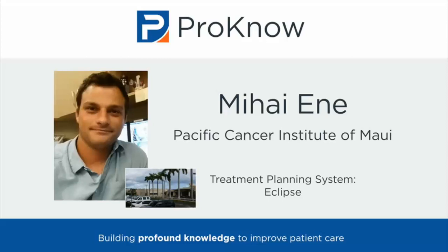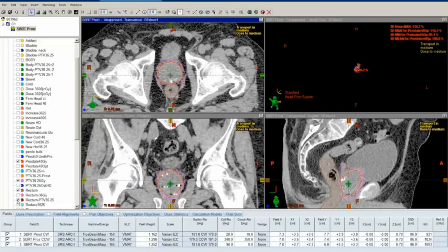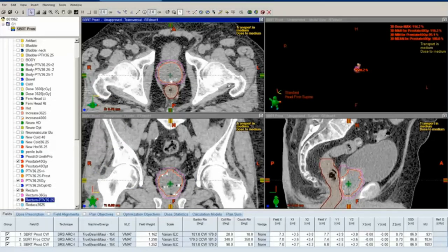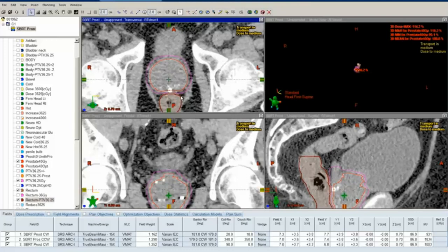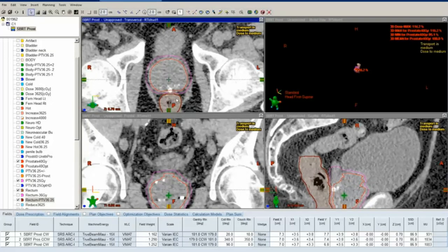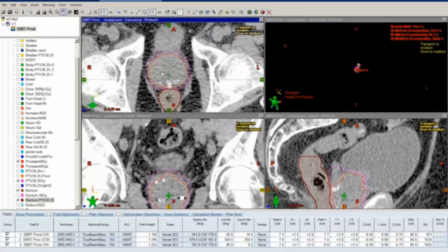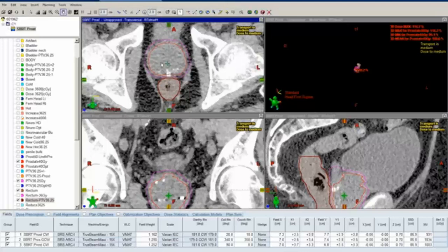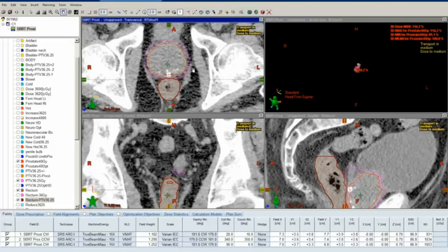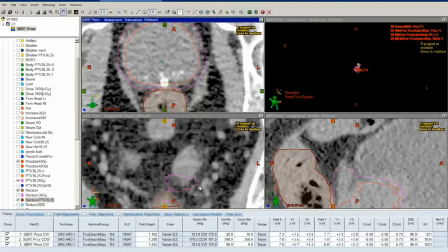We provided the original structure set. What, if any, additional structures did you create? I created RectumOpt, which is just the rectum minus PTV36.25 with a one millimeter margin, and that just helped the optimization so that there's not too many conflicting calculations.